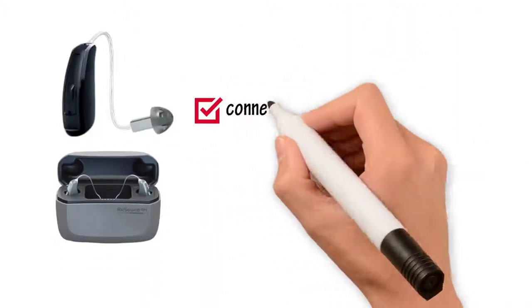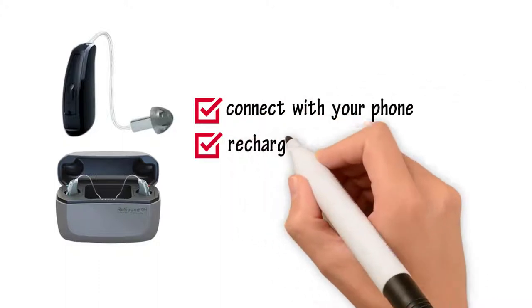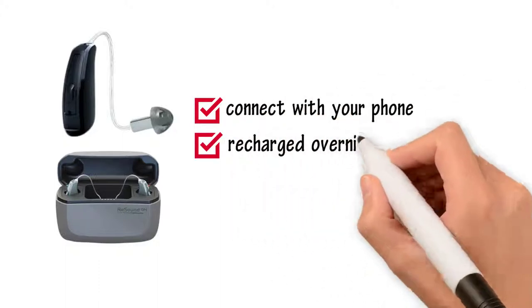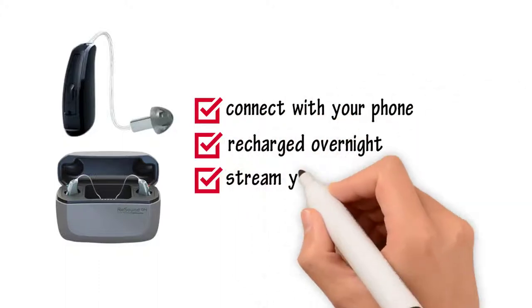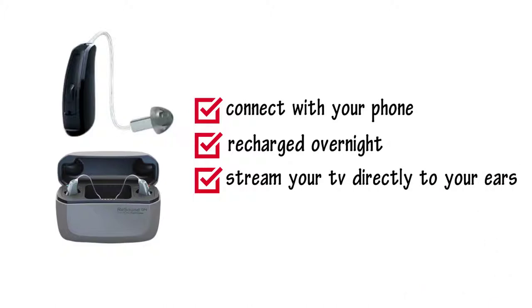Your hearing aids can now connect with your phone, can be recharged overnight, and can even stream your TV directly to your ears.